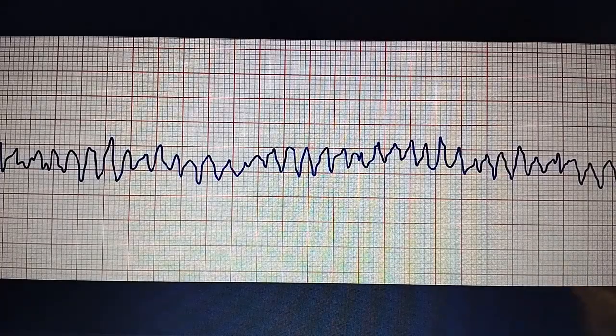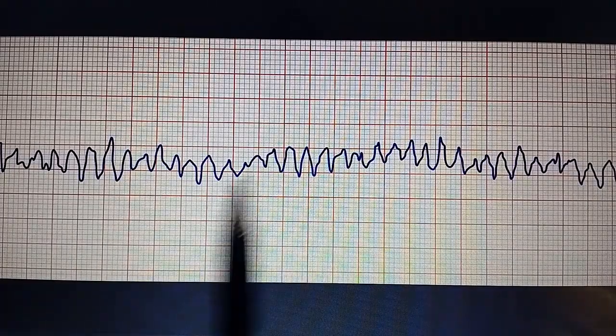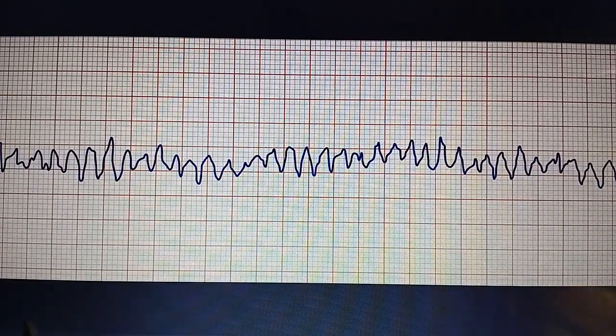And as the duration keeps on increasing in the case of ventricular fibrillation, the coarse ventricular fibrillation gets turned into the fine ventricular fibrillation, and progressively it can turn into asystole if the patient is not treated urgently. So ventricular fibrillation is very lethal. It has to be treated very efficiently.